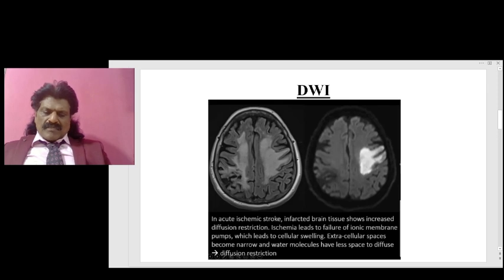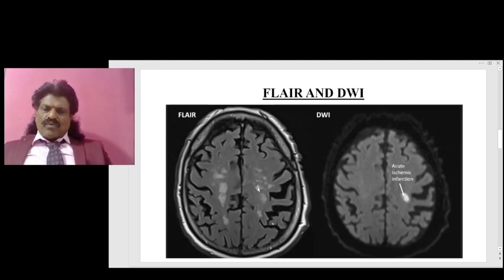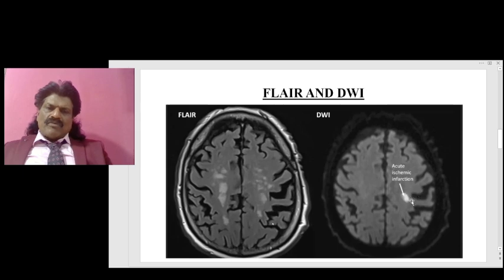Here you can see the advantage of DWI over FLAIR. The FLAIR — Fluid Attenuated Inversion Recovery — sequence has not yet picked up the lesion, but on DWI you can clearly see the bright signal. This is because of cellular swelling and reduction of intercellular space, so water molecules are not able to diffuse — there is diffusion restriction — and it appears bright on DWI.